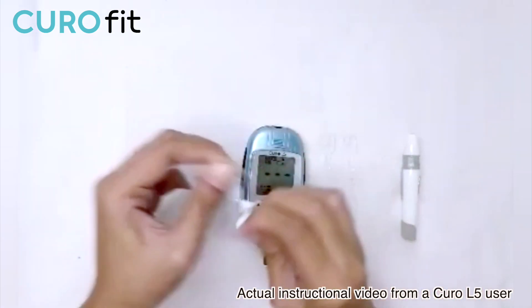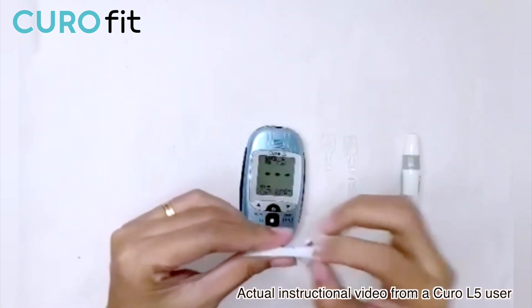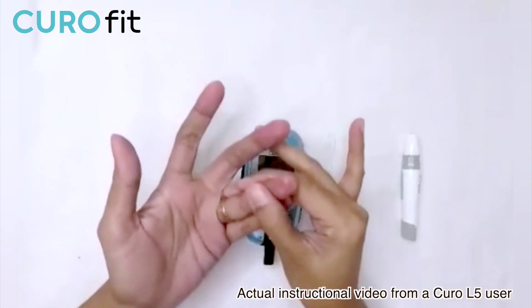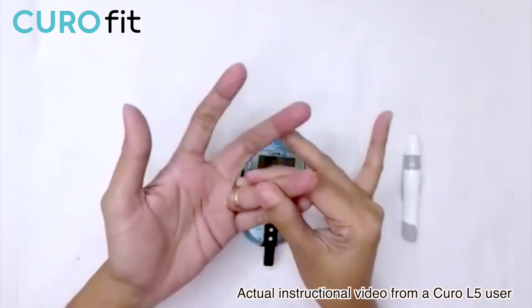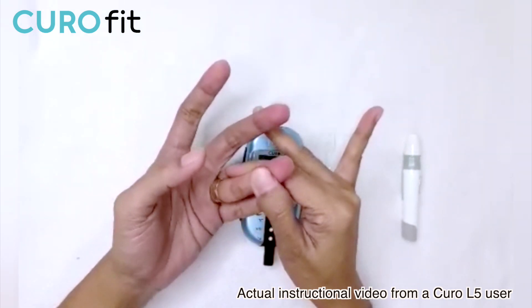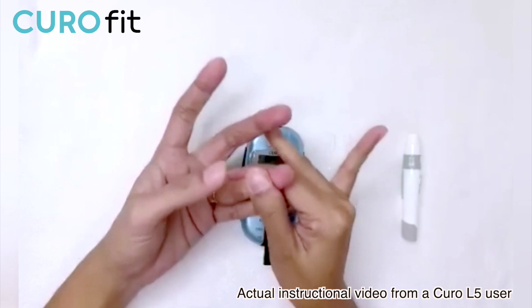I am now ready to start the test. Let me just sanitize my finger to make sure there's no residue left. Let me just massage my finger first, because it will actually help the blood flow into my fingertip.